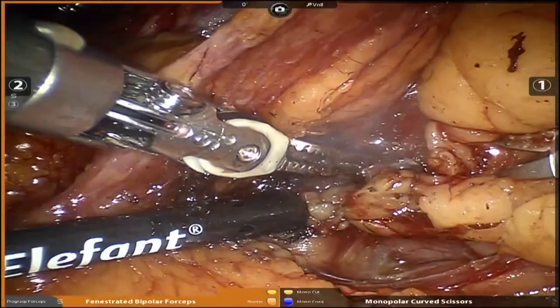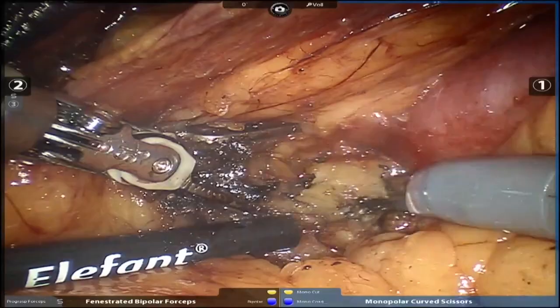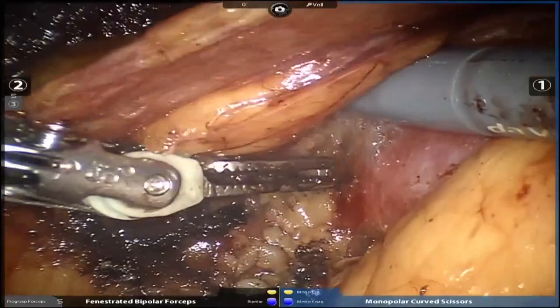The reason is that there are logistics with getting the ultrasound in the room. If you only ask for it periodically, you only get it half of the time. So asking for it every time in our hospital means that we get it every time. But also, I think it's important to become very good with ultrasound. The more you look at ultrasound, the better you become.